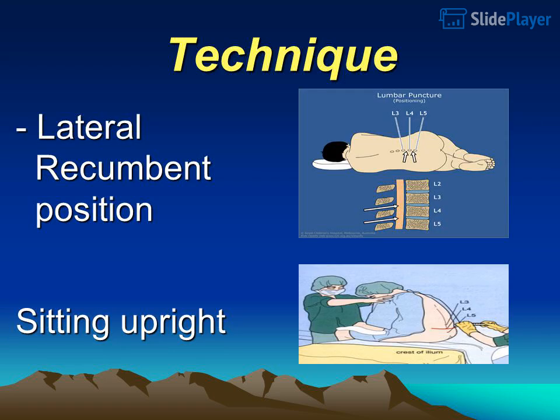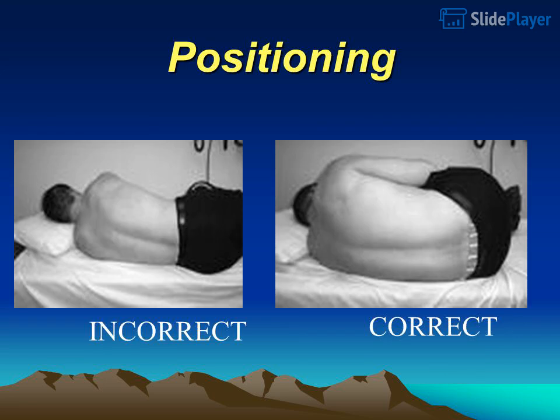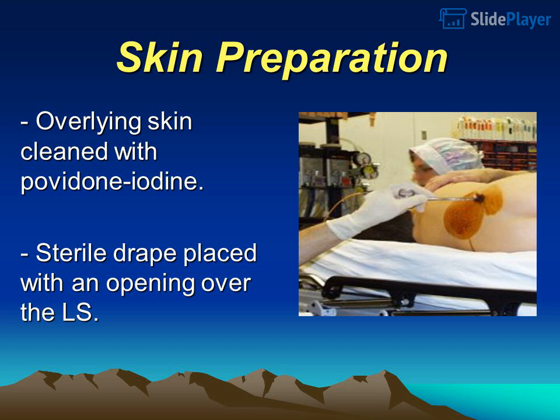Technique: lateral recumbent position, sitting upright. Positioning: correct, incorrect. Skin preparation: overlying skin cleaned with povidone iodine. Sterile drape placed with an opening over the lumbosacral area.